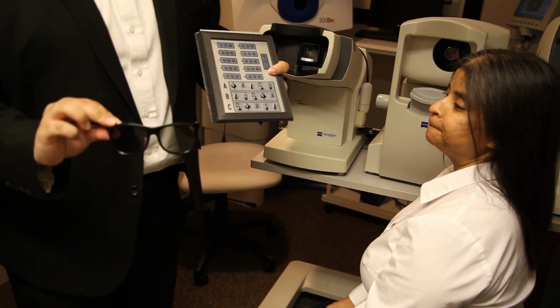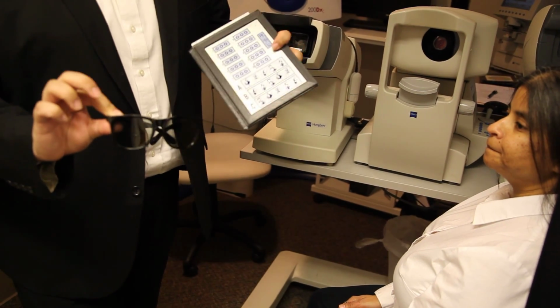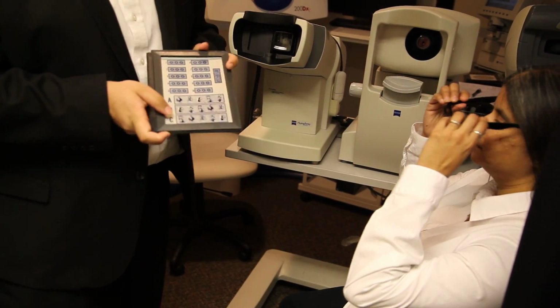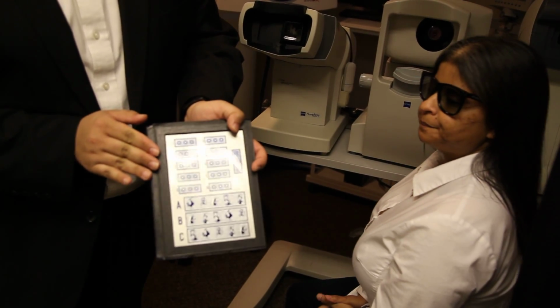So for the stereopsis test, you're going to ask the patient to wear these 3D glasses, or quote-unquote sunglasses. Ma'am, if you'll put on these sunglasses for me. Sure. And you're going to show them this series of pictures here.